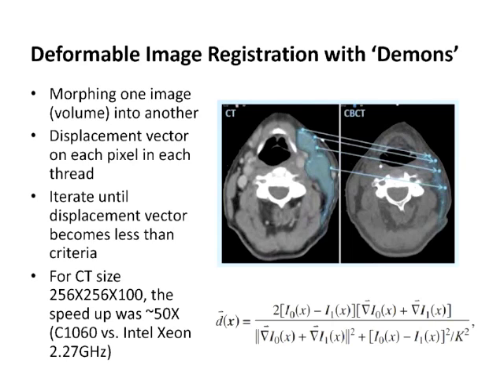Okay. So image registration uses the Demons algorithm. This one was the original image with the tumor, and this one is the CBCT at the time of the patient's treatment. The difference from CT is that CBCT is much simpler, more concise, smaller. You can do it quickly when patients are treated on the same day.